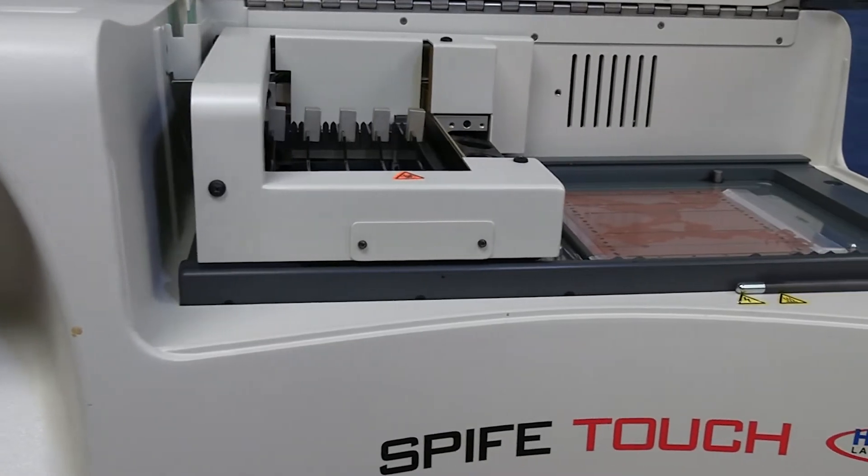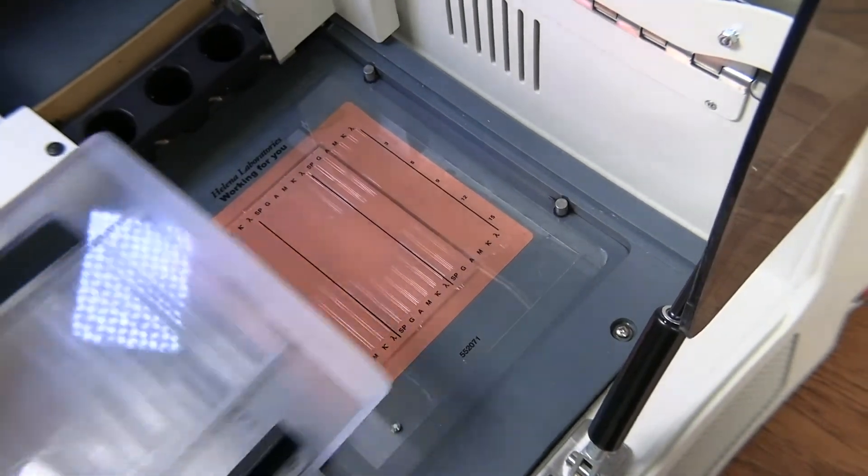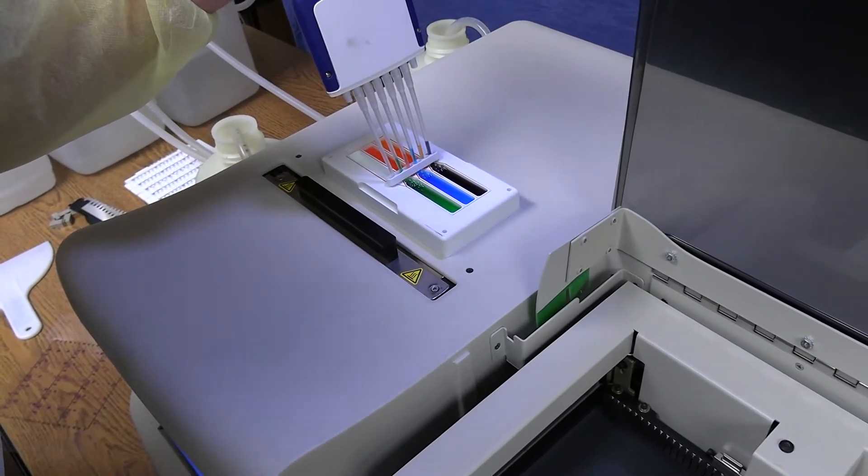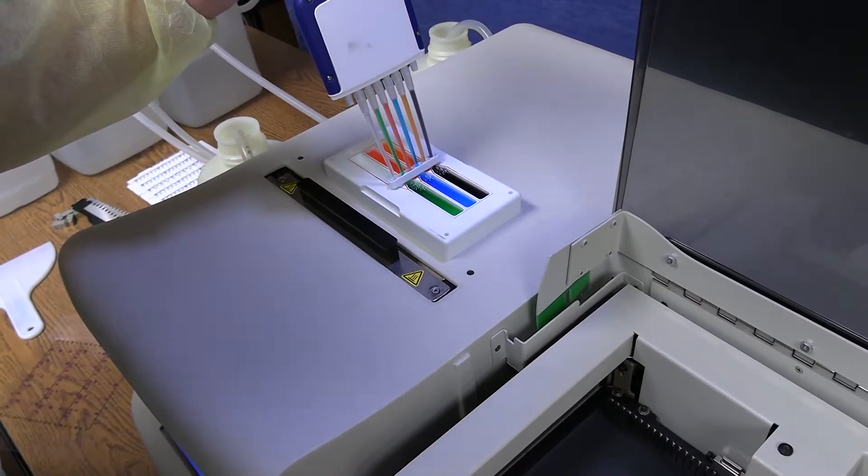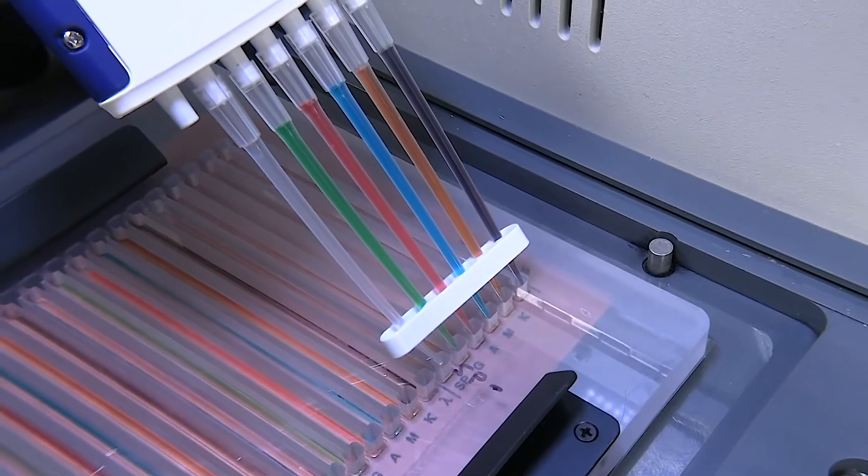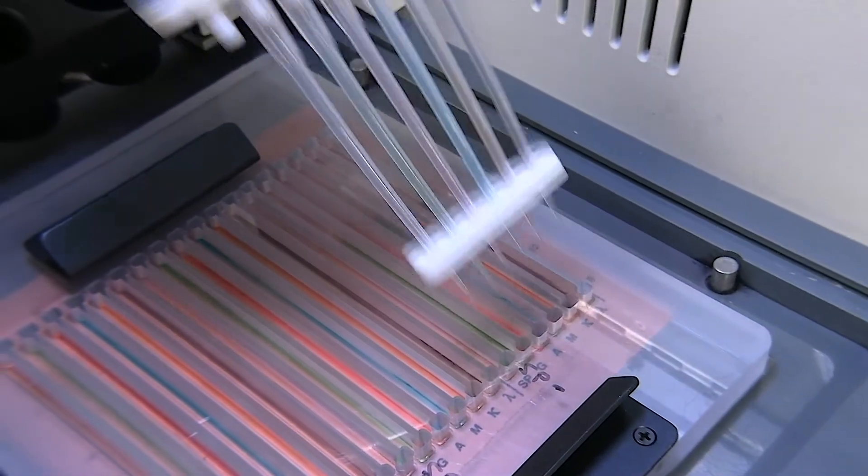IFE testing is simplified by the use of the anti-SERA template placed over the gel to allow swift anti-SERA application with multi-channel pipetter. This pipetter dramatically reduces the number of pipetting strokes needed. To apply anti-SERA for an IFE 15 patient gel requires only three pipetting strokes.